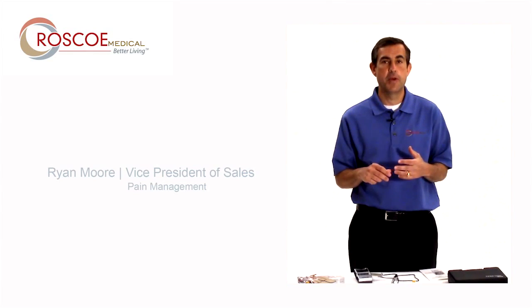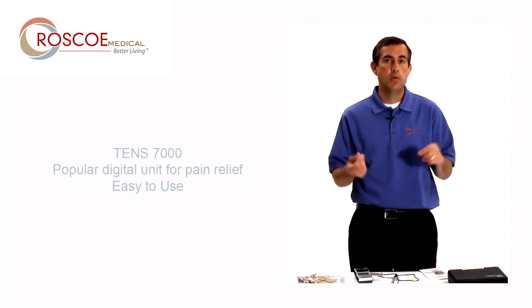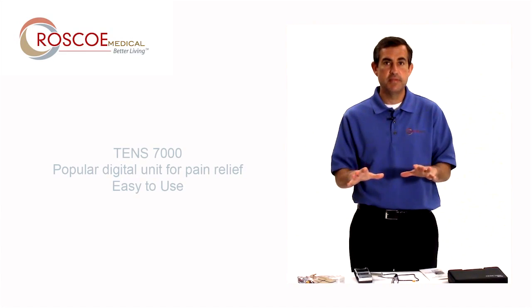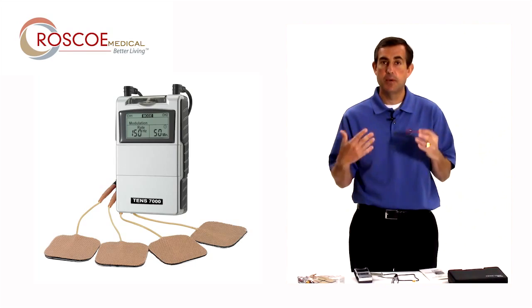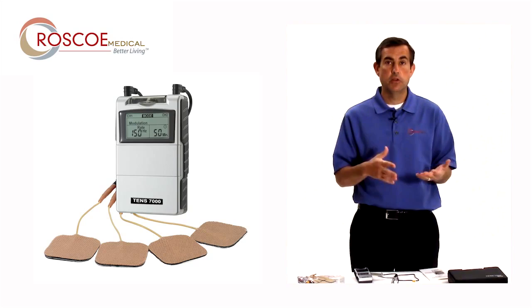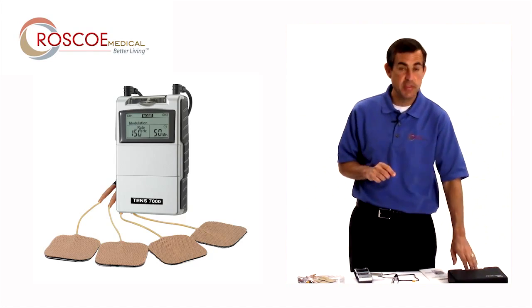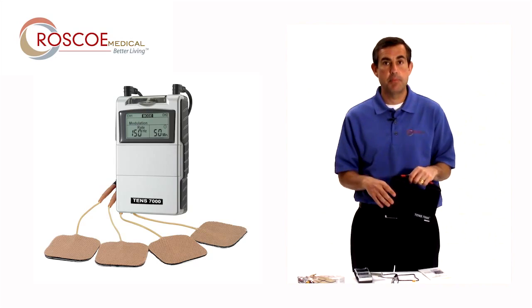Hi, everyone. This is Ryan Moore with Roscoe Medical. Hope you're doing well. Thanks for listening. This is a video today on how to basically set up the TENS 7000. We're not getting into large amounts of detail on this. If you need more information, come to our website, roscoemedical.com, or get with your dealer or dispensing physician for more information. But real quick setup on the TENS 7000, one of our most popular digital units.